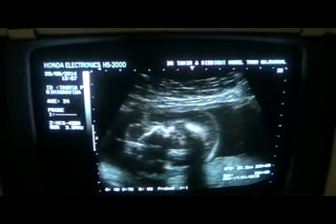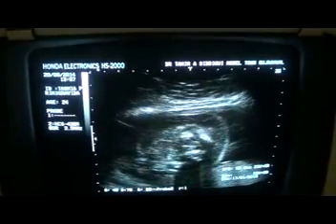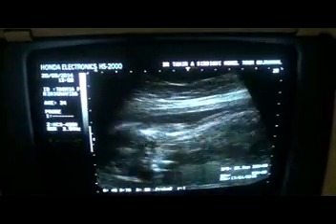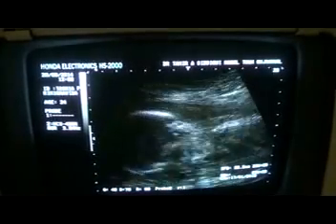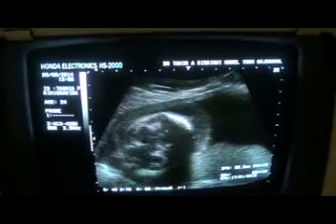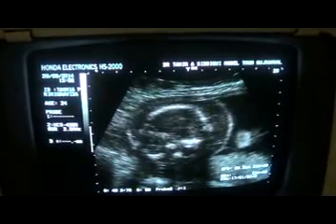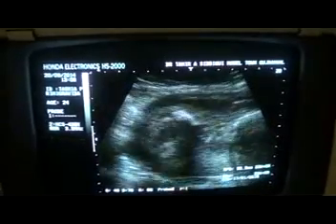however you can see edema around the skull. This is the skull, and it is surrounded by, now these are the skull bones, and this is the edema around the skull, that of the fetus. Now you see again in this view, this is all edema. This is edema of the skull.